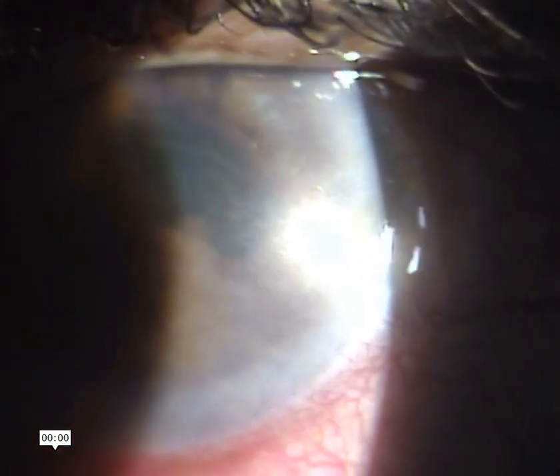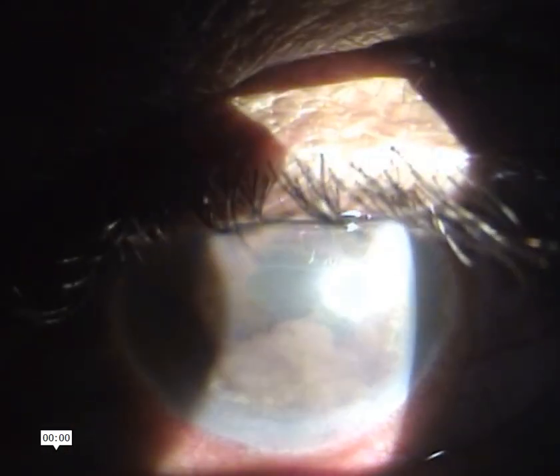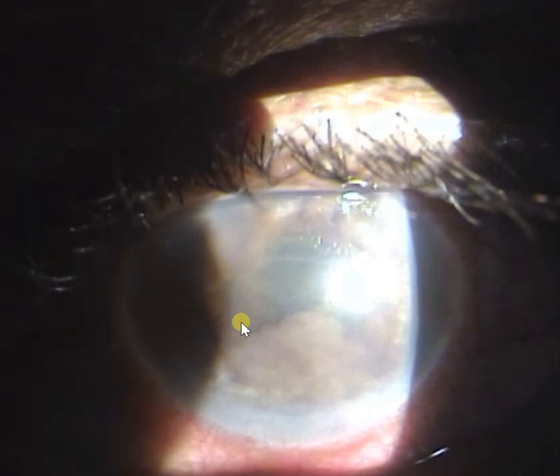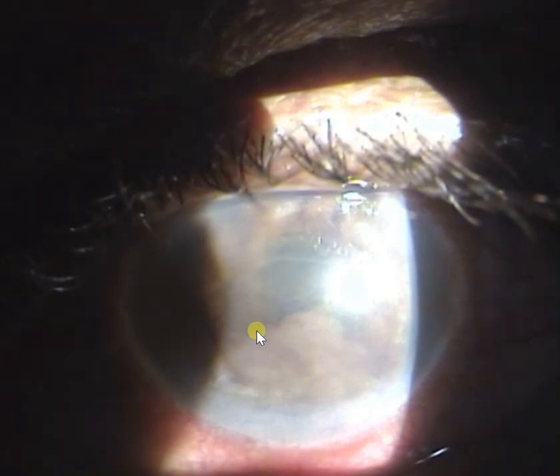and the reason for that is iris bombe due to the presence of seclusio pupillae, which is causing this iris bombe in this patient. And let's stop the video and draw over here for you. If you see, this is the tool which you're using. So if I draw over here, this is the area where we've got the posterior synechiae present 360 degrees, and if they are present 360 degrees and they divide the two cavities of the anterior and posterior chamber, they are called a seclusio pupillae, right?